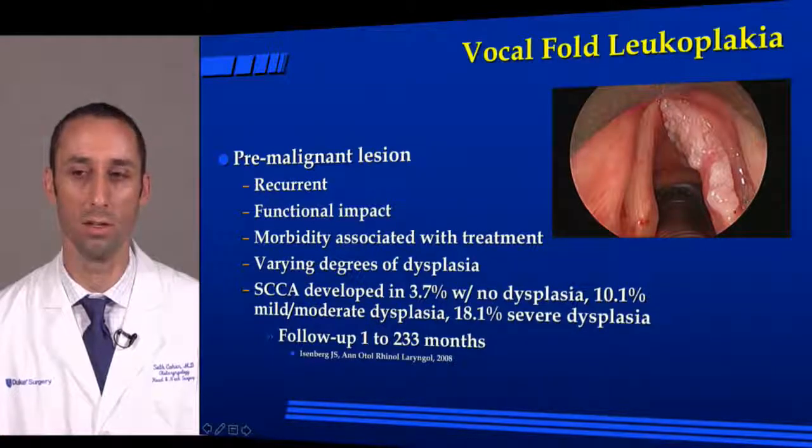And then you're going to use your elevator to elevate all this area because this is all diseased. And you can see it extends even down into the subglottis here. And this gentleman wound up having severe dysplasia or carcinoma in situ. So if I just took a biopsy of this here, I would have missed potentially his disease.